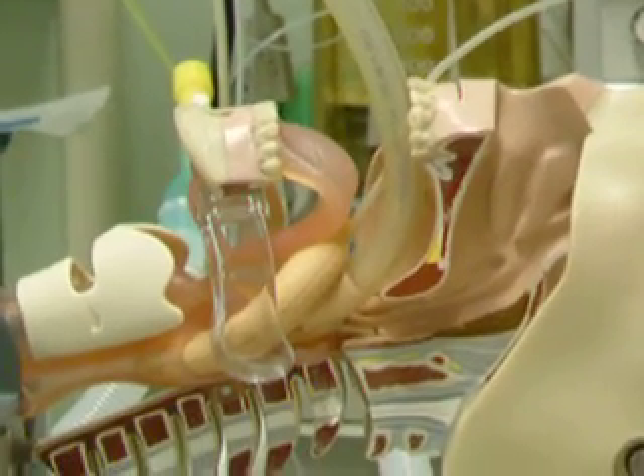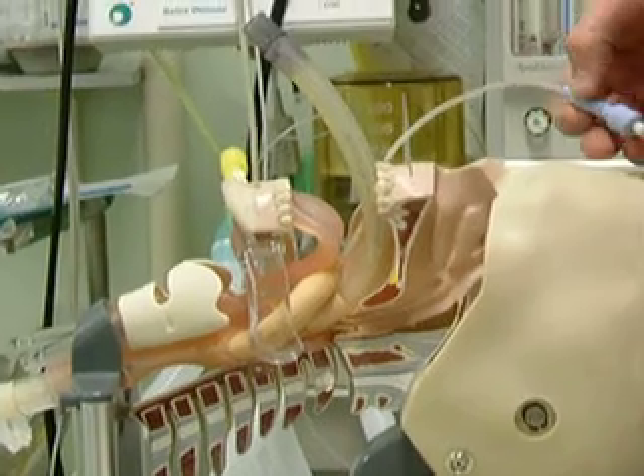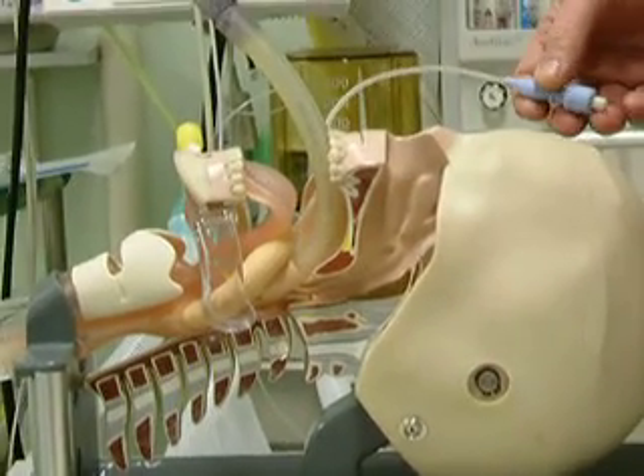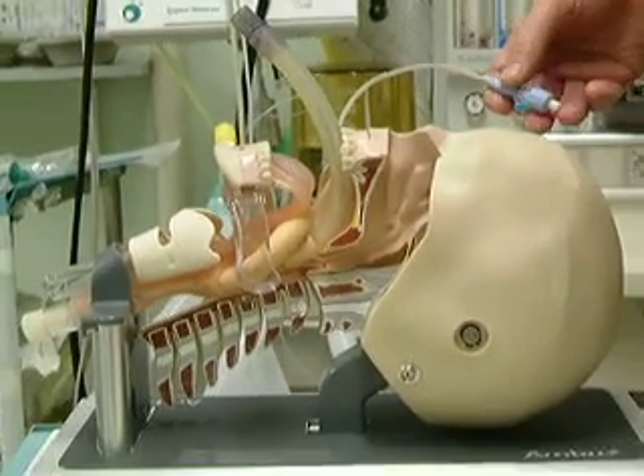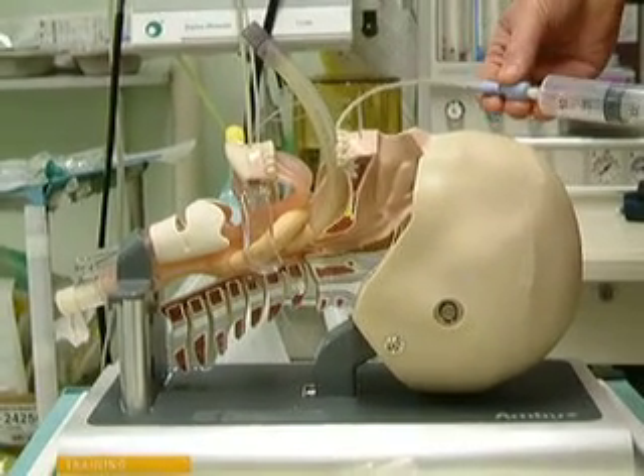If I put it in on this mannequin, it gives you some idea of the high pressure that can be achieved with a small cuff. I think you can see that.